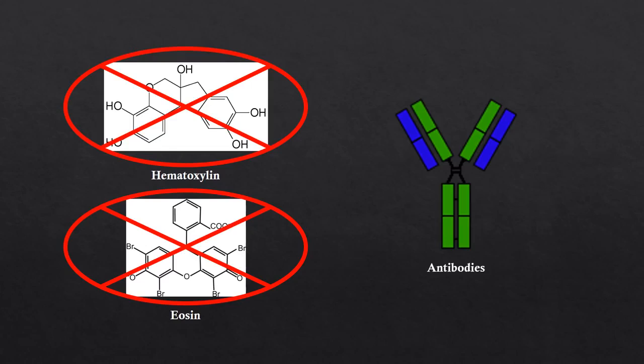Remember how H&E stains use a hematoxylin stain and an eosin counterstain to stain the tissue? Well, these two chemicals are called staining reagents. The goal of a staining reagent is to be able to locate certain molecules and attach them inside the tissue that has generally been treated in a certain way. Furthermore, the staining reagent must then be able to change the color of itself or the objects locally around it so as to make the identification visible. In immunohistochemistry, we utilize antibodies as our staining reagents instead of standard and broad-acting stains used in histochemistry.